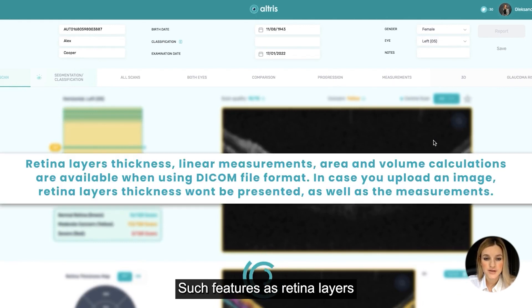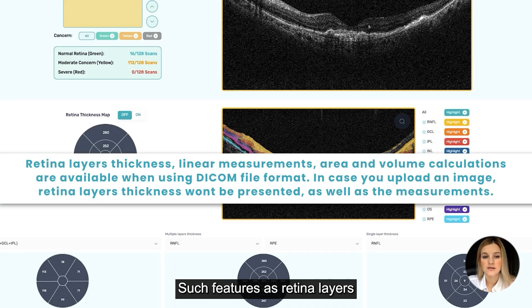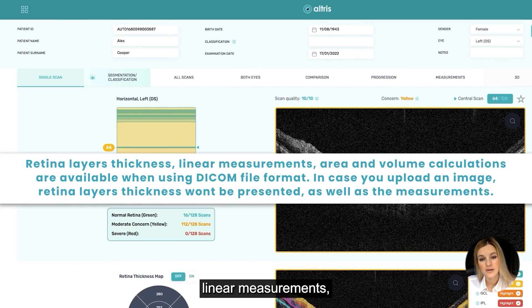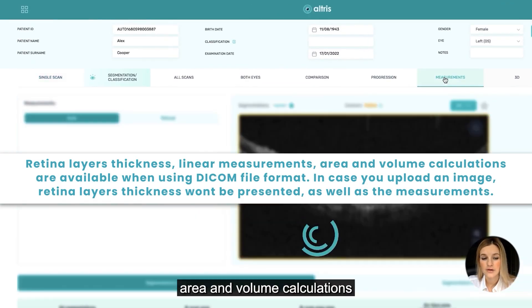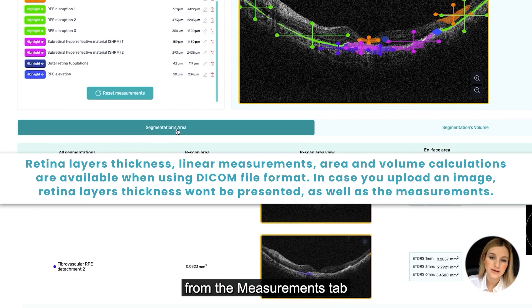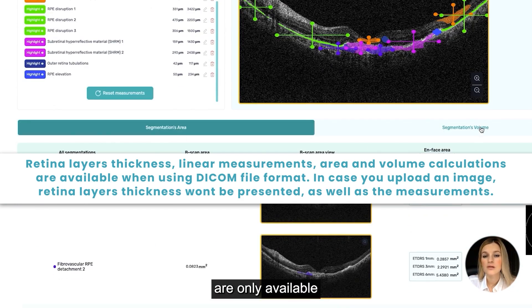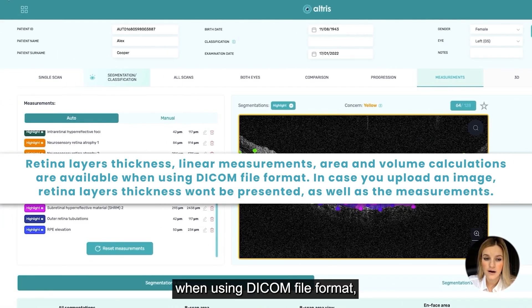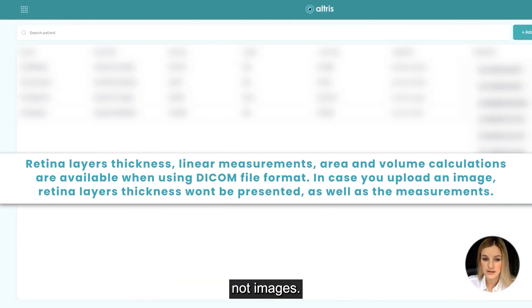Such features as retinal layers thickness in a single scan tab, linear measurements, area, and volume calculations from the measurements tab are only available when using the DICOM file format, not images.